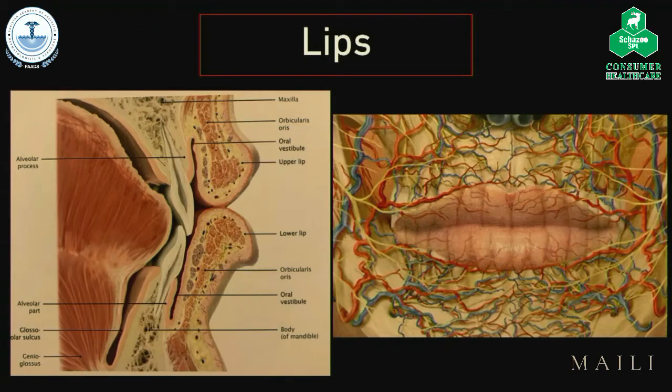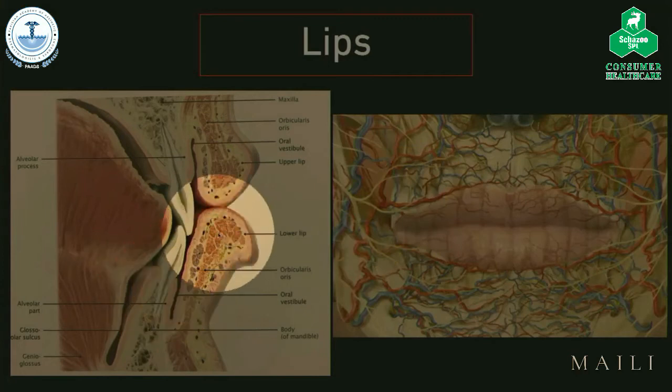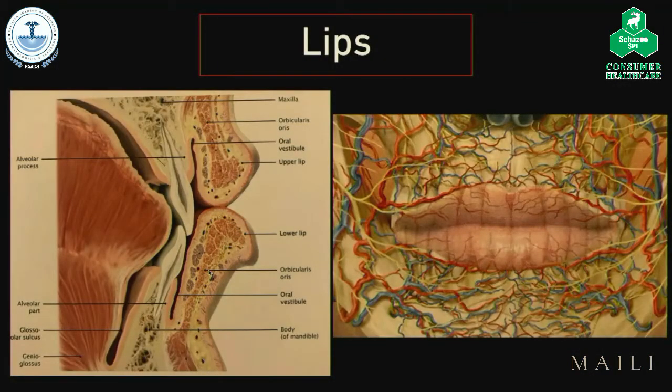The thing is, you see all these representations, and look, the lip has mucosa and muscle, skin and muscle. There's no fat on the lips. And sometimes you see people say, oh, we have to inject subcutaneous or submucosal. There's not a real space between the mucosa and the muscle. You create it when you inject. So you have to be careful with that. That's the main thing, it's about pressure and quantity.